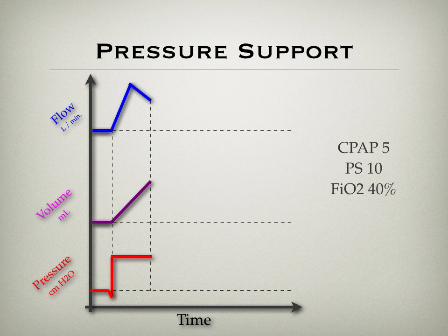And when that happens, the machine will mark the peak of the flows and will wait for a 25% drop, and that's modifiable in many ventilators. And then when the 25% drop from the peak happens, that means that the lung is almost full of air and the patient has had enough breath. And hence the patient will be allowed to exhale by dropping the pressure back down to the baseline, and the patient will be allowed to exhale.